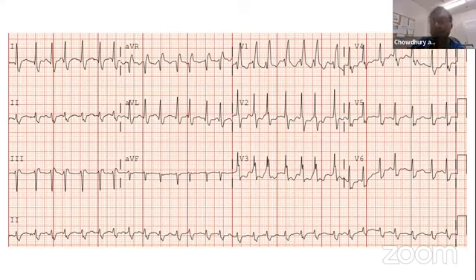So, Dr. Kundu presented an EKG with right ventricular hypertrophy and P pulmonale, which fits in very well with mitral stenosis. Remarkably, that patient was in sinus rhythm with the mitral stenosis. But this patient has a tall R wave, and the axis is left axis. The question is, we read it as atrial fibrillation and bifascicular block. Will you call it right ventricular hypertrophy as well?